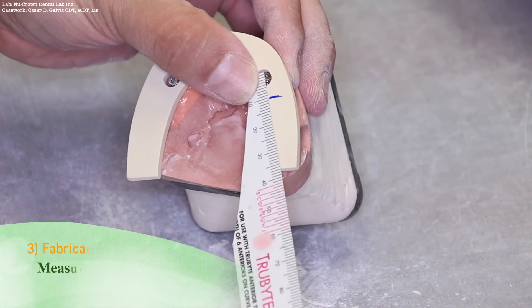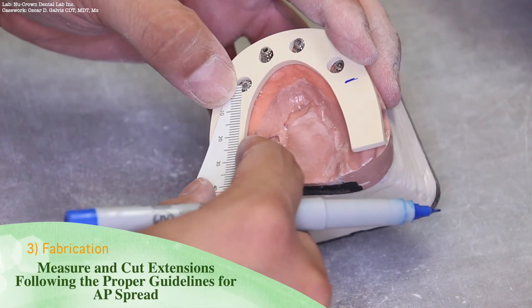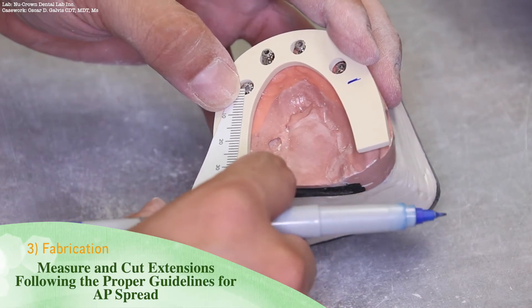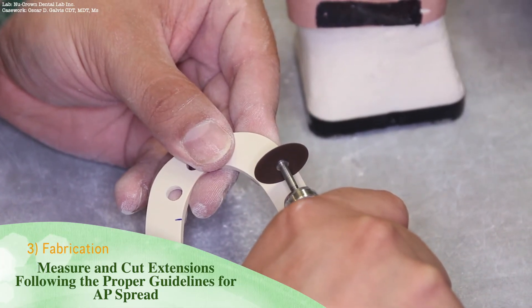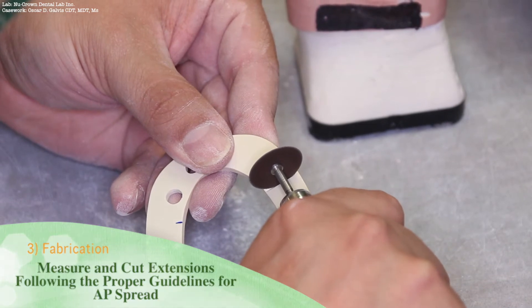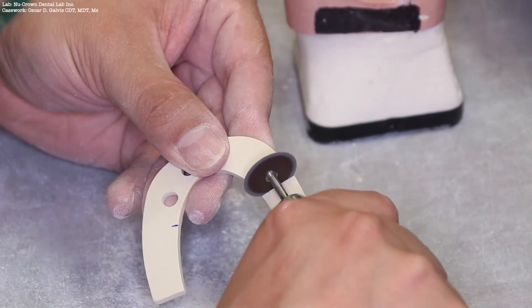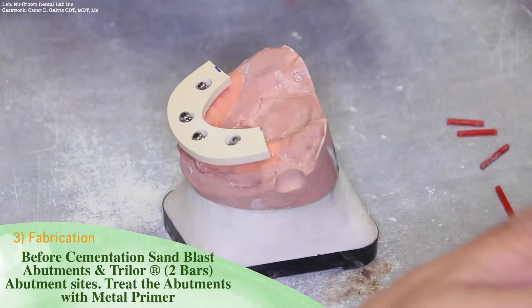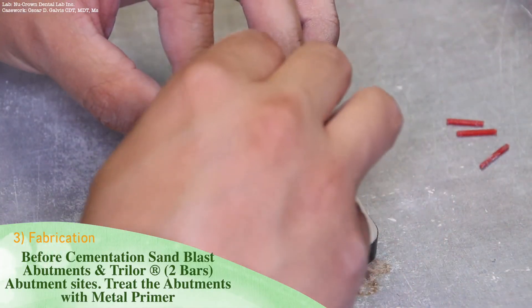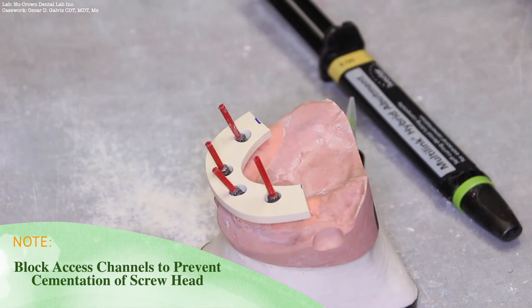Following AP spread guidelines, measure and cut any extensions. Before cementing the Trilor substructure to the titanium abutments, be sure to sandblast the titanium abutments and the Trilor at 2 bars pressure. Treat the abutments with metal primer as well. It is also good practice to block the access holes to prevent cementation of the screw heads.